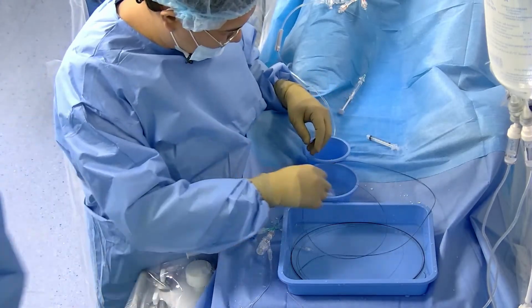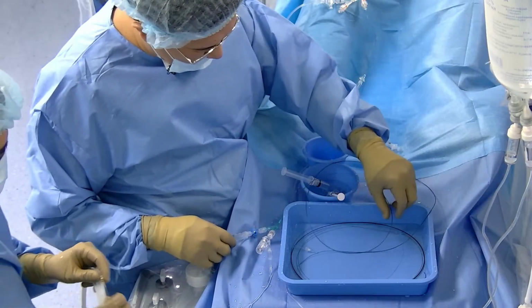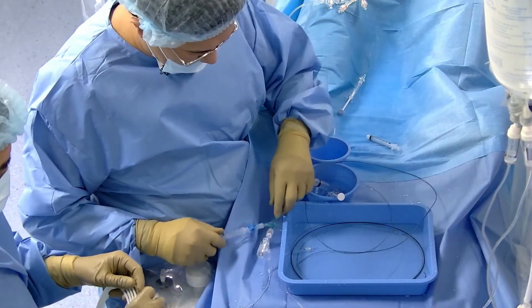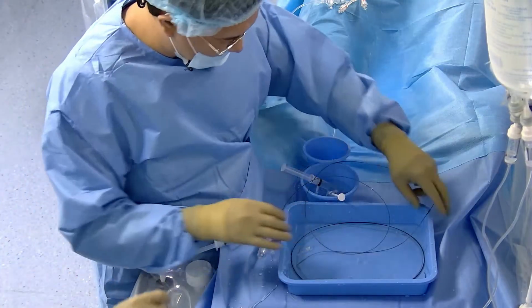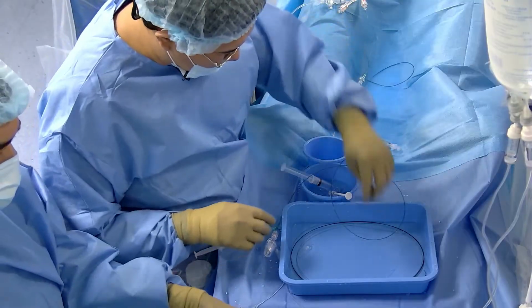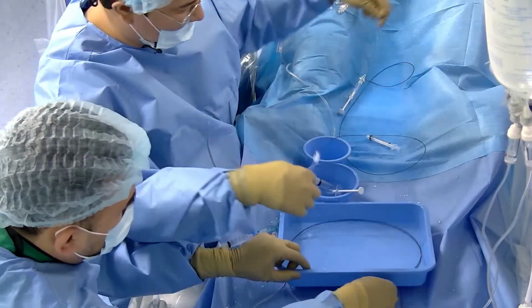It's also possible to inject a little bit of glue, but because of the close location of the fistula to the draining vein, I will try to avoid using the glue. Glue is very effective, but it might create thrombosis of the draining vein.